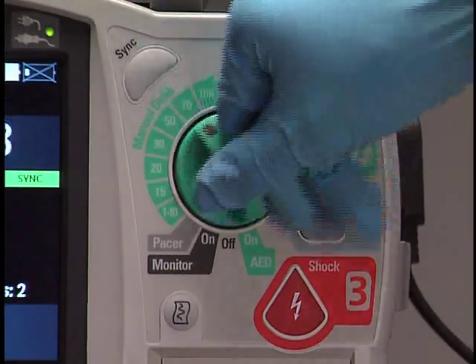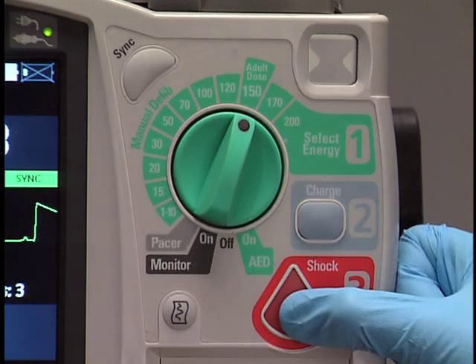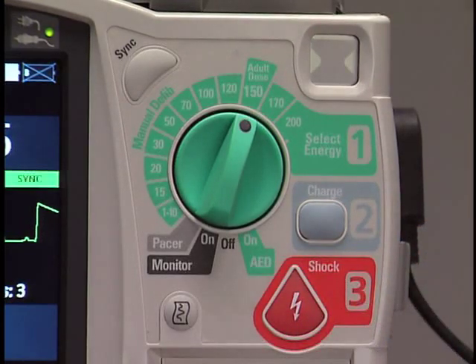Turn the therapy knob to the desired energy level setting. Press the Charge button on the MRX. Make sure no one is touching the patient or anything connected to the patient. Press and hold the Shock button on the MRX. A shock delivers on the next detected R-wave.